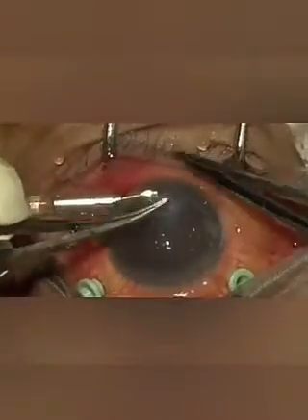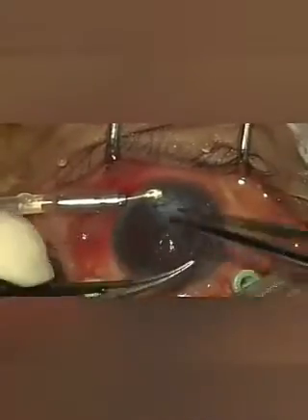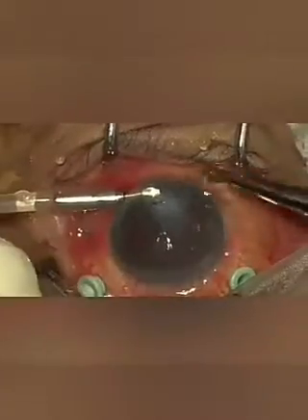A full thickness corneal tear extending from 7 to 10 o'clock can be easily sutured in the presence of the anterior chamber maintainer with the help of 10-0 nylon sutures.